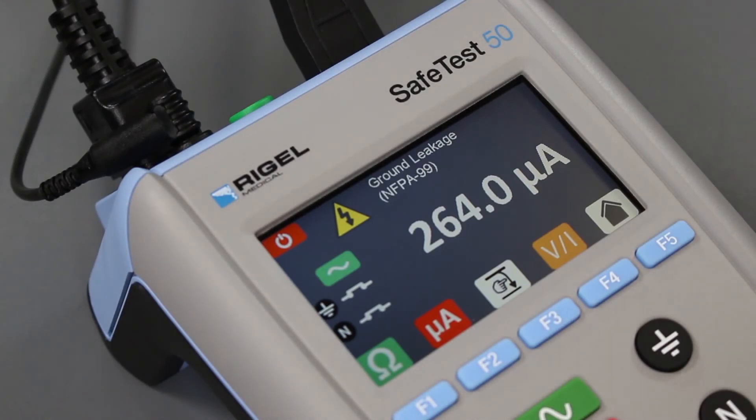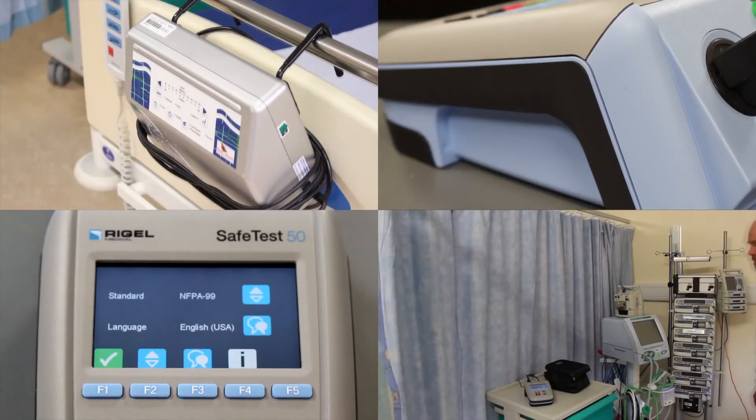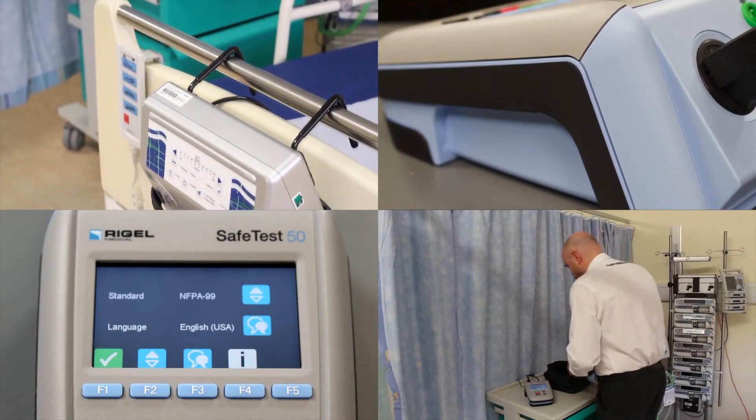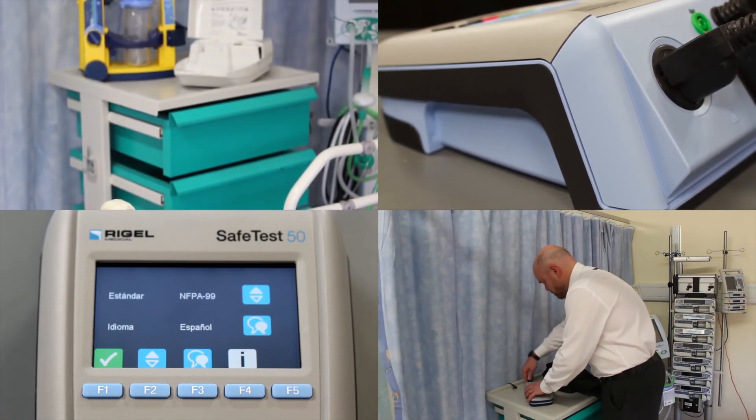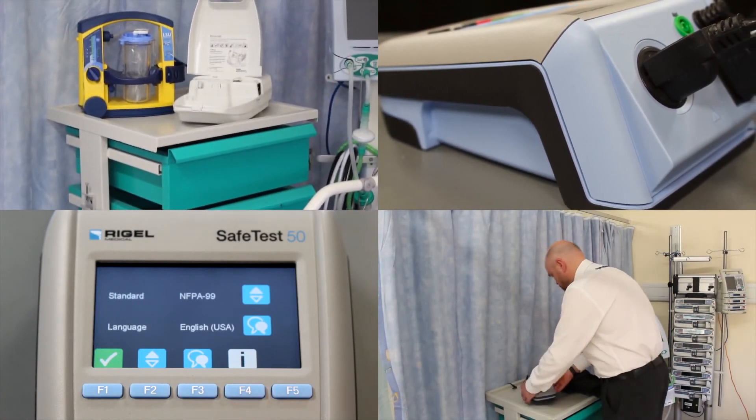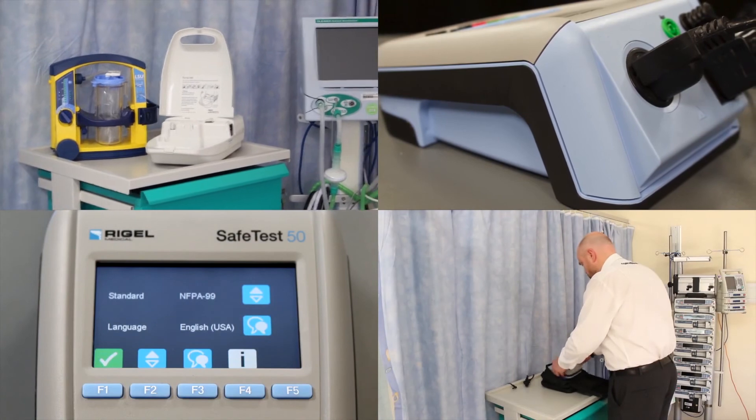Available in a number of mains socket configurations and with selectable language settings, the SafeTest50 is a versatile and rugged solution for quick and cost-effective testing of electronic equipment in the medical and laboratory environments.